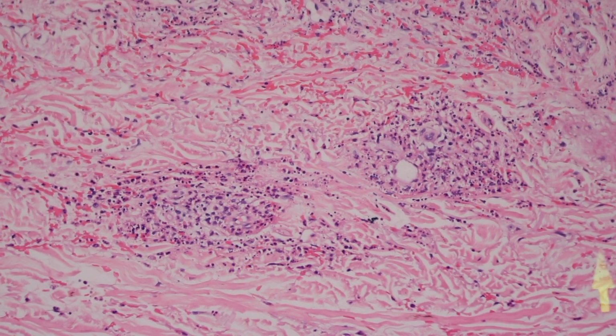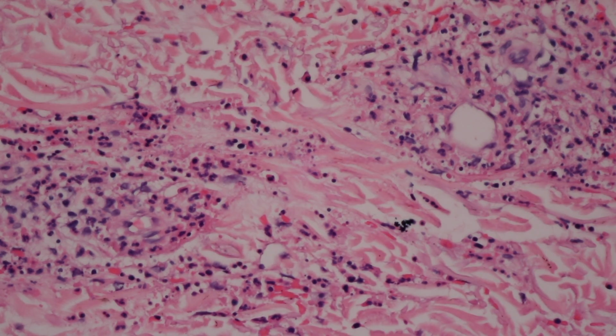And what's happening is that around the outside of the vessel, let's go down one higher power here and see if we can get it in focus. Around the outside of the vessel, you're seeing a bunch of inflammatory cells, and most of them are neutrophils. Sorry, still trying to focus here. There we go. Mostly neutrophils, and a lot of the neutrophils are breaking down into tiny little nuclear particles, nuclear debris. So we call this process leukocytoclastic, that the neutrophils surround the vessel, and in damaging the vessel, they break down into karyorrhectic nuclear debris.